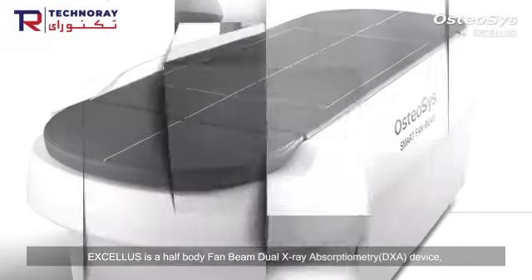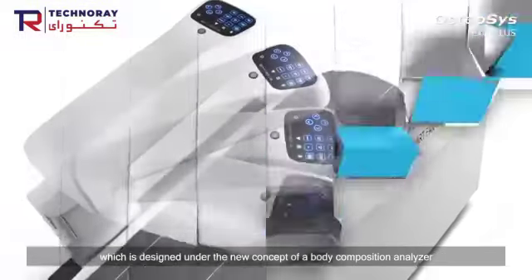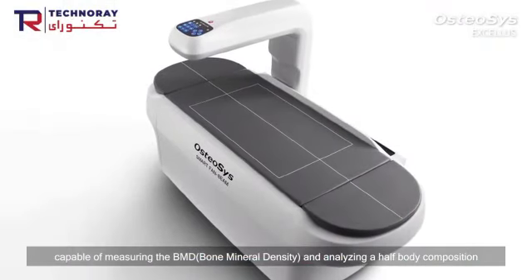Exilus is a half-body Fan Beam Dual X-ray Absorptiometry device, which is designed under the new concept of a body composition analyzer, capable of measuring BMD and analyzing half-body composition.